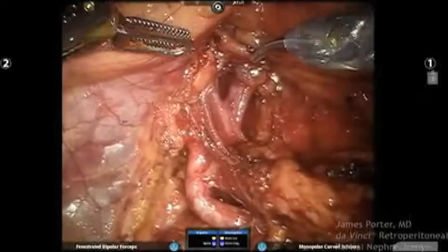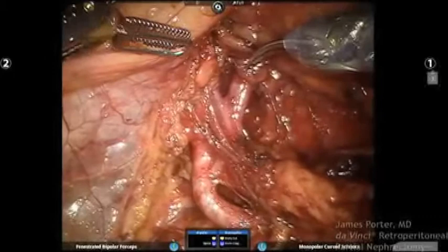Long on the vein, okay? Long clamp on the vein. We're going to try and get both veins in the single clamp, okay? Sorry about that, I had to talk to Nancy. No, that's fine.